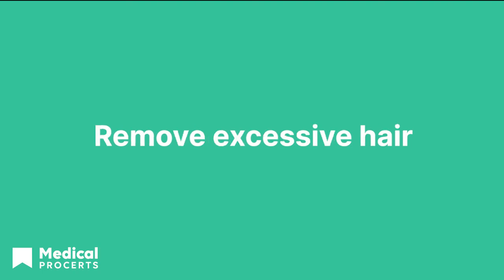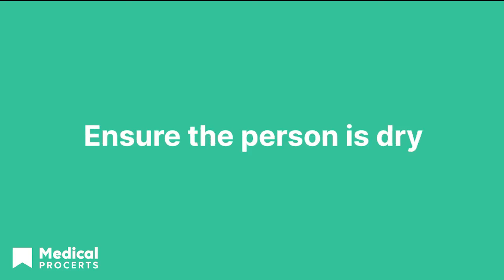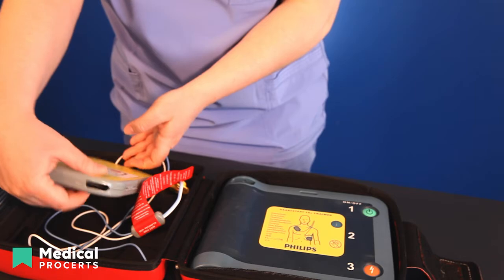If the person has excessive hair, the electrodes will not make sufficient contact. If a razor is not available, you can press the AED pads firmly down on the contact area and remove them quickly to pull the hair from the chest. Replace them with a fresh set of pads. Ensure the person is dry. Water can interfere with the shock by making the pads less sticky and compromises the electrical conduction.